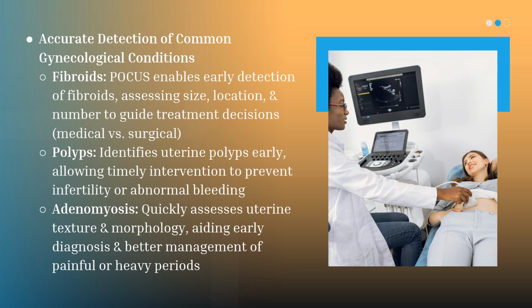For polyps, especially if they're caught early, you can really help with preventing infertility, abnormal bleeding, and potentially turning into cancer down the road. So you want to be able to accurately identify those things and then pass them on to the right people that can further evaluate what you found on the ultrasound.